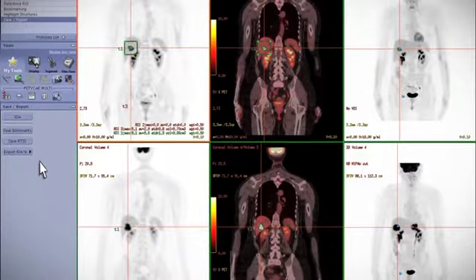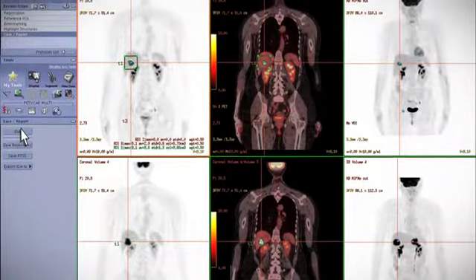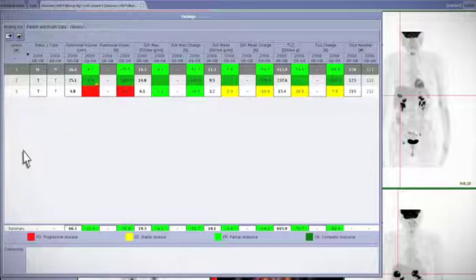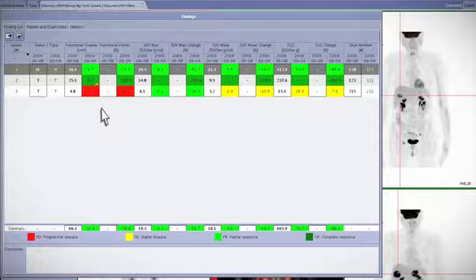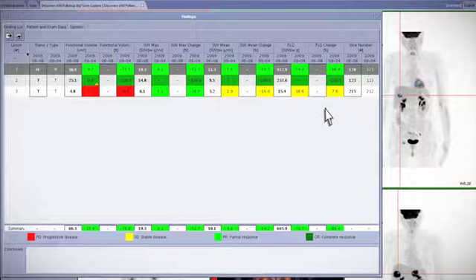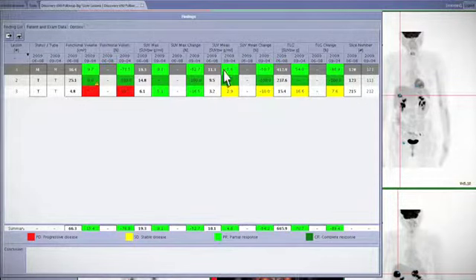The physician may add comments about the lesion and its characterization. The interactive data analysis takes all the lesions found on the exams and graphs them in an easy-to-read longitudinal analysis. This page can be customized by the clinician depending on the information they need. This interactive data analysis file shows the volume, max SUV, dose, and uptake time.